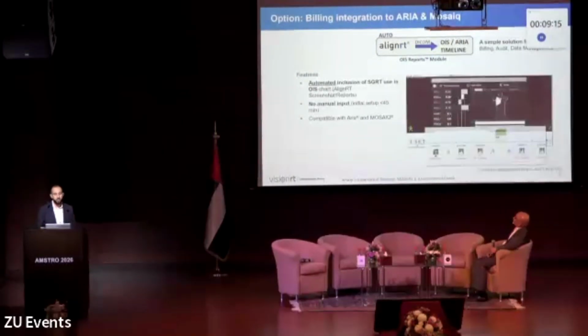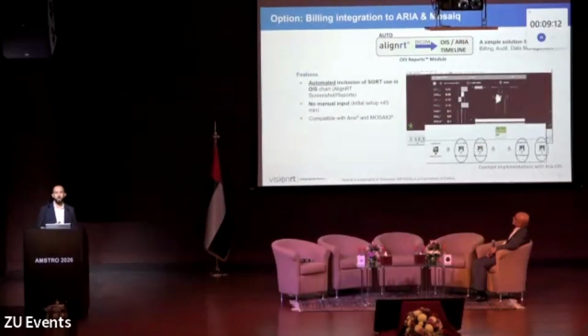So you can access the reports from the SGRT treatment directly on Mosaic or ARIA, and it will allow, for example, the doctor, the consultant, to verify the treatment directly with the IGRT. And it will also be useful and beneficial for billing purposes.